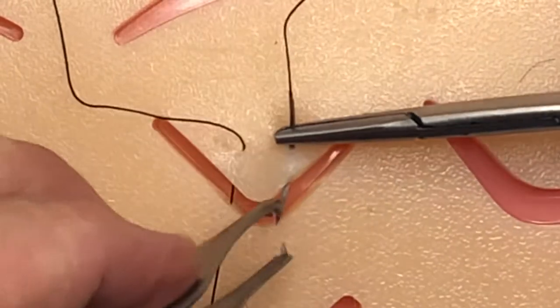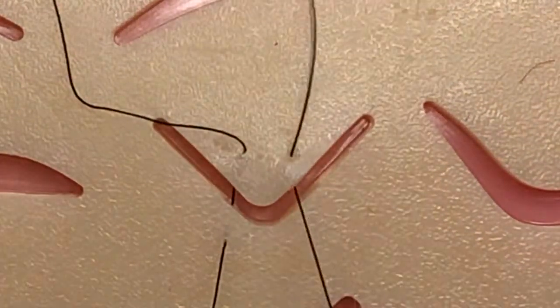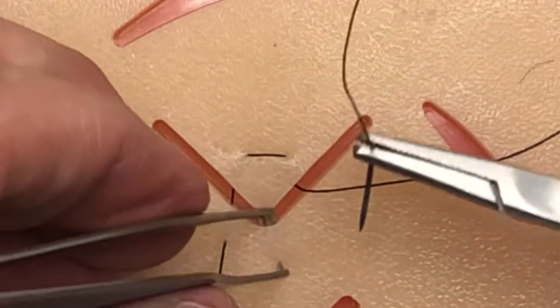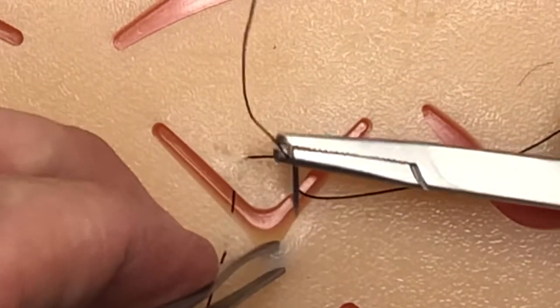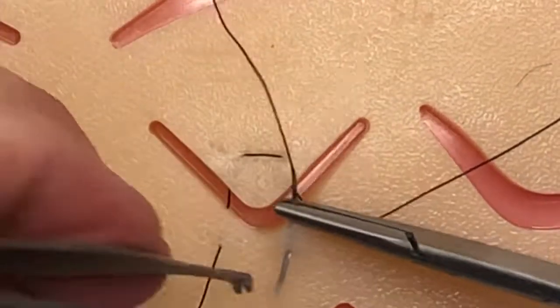And out through, using our tissue forceps, and then come out right about here.